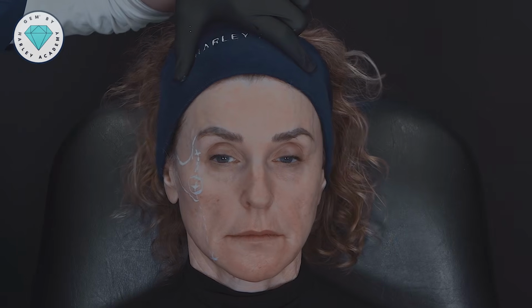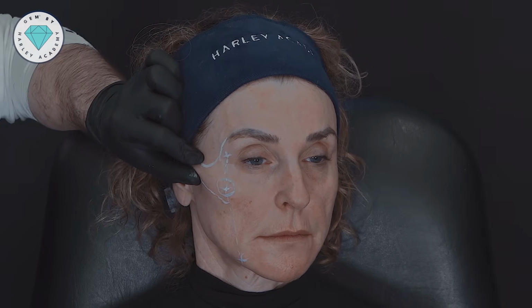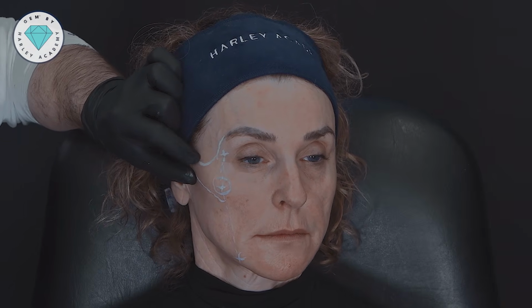And what we can already see is because we've got actually very beautiful natural cheekbones and we've got some volume loss medial to this, this is already well projected. That doesn't mean to say that we shouldn't add a bit more structure, and we're doing that deliberately in order to follow our treatment plan principles and make sure that we're not overfilling medially. So I do think we need to add some volume to the apex of the cheek, and then we're going to use a cannula to taper off the zygomatic bone laterally. All of that isn't to try and create lots of projection laterally, because she does have very good, beautiful, defined cheekbones, but it's to start to add this structure, which is going to be important if we're going to try and get the best results in the medial cheek.